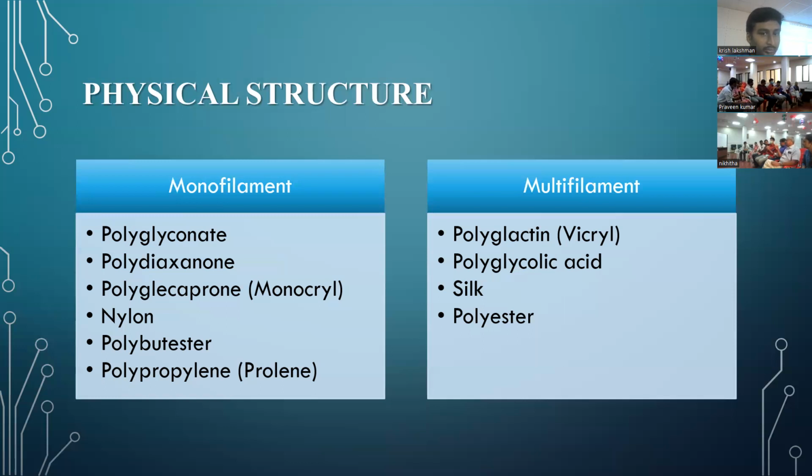And is there a method to overcome the disadvantage of multifilament? Since it is twisted and there are grooves, bacteria get lodged. Is there a mechanism where that can be avoided, even in a multifilament? That's nice. What do you call it?